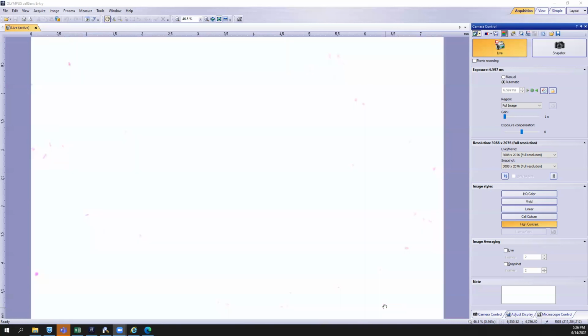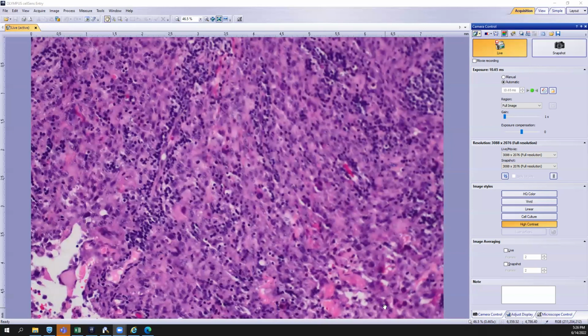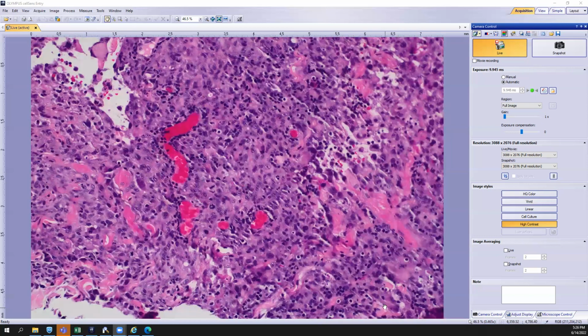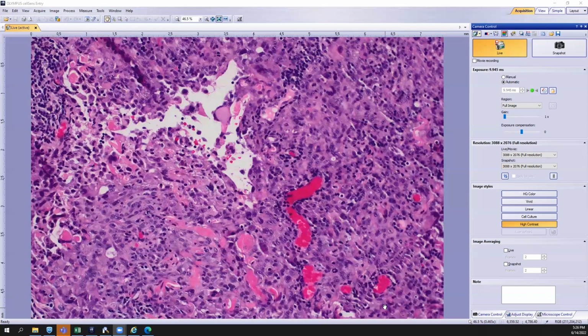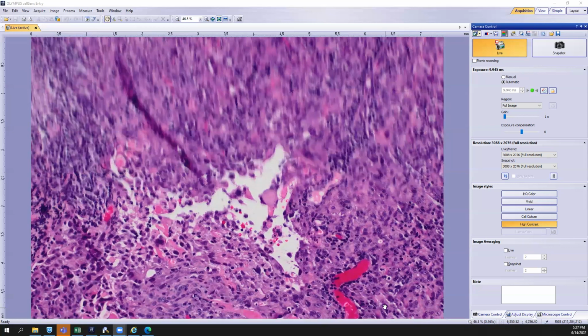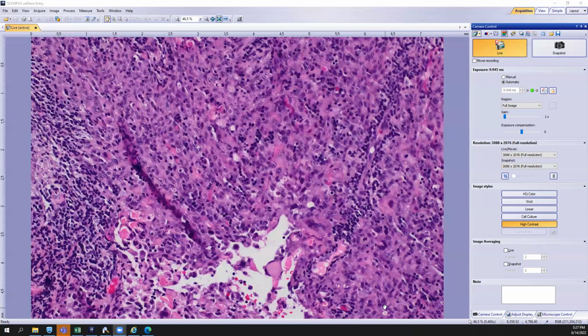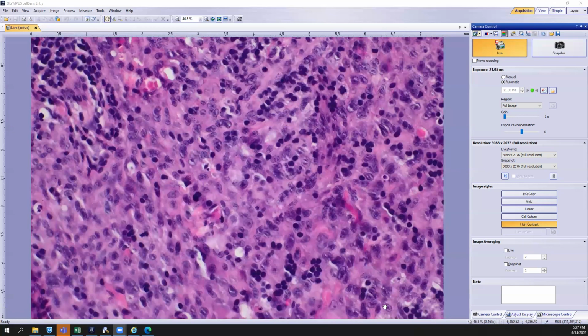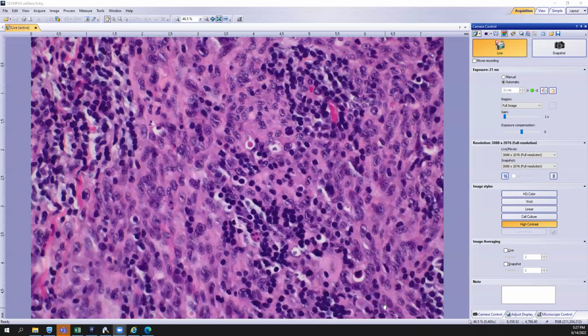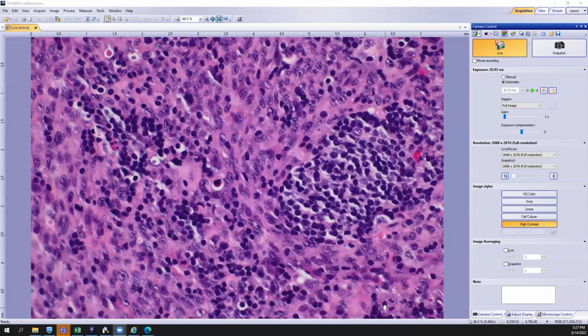because there seems to be an epithelioid population that might even be forming new areas of lumen here. You can see that some of these areas have open lumen and maybe some endothelial or epithelioid cells that appear to be in the lumen, and they appear to be stacking, very pleomorphic. On higher power, you'll see prominent nucleoli. If you scan around the slide long enough, you'll find several areas of mitotic activity as well.